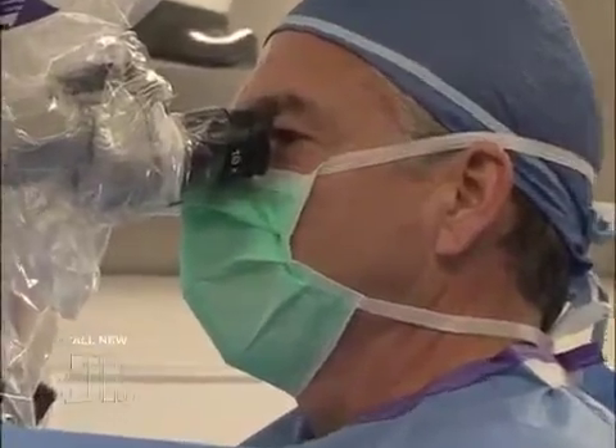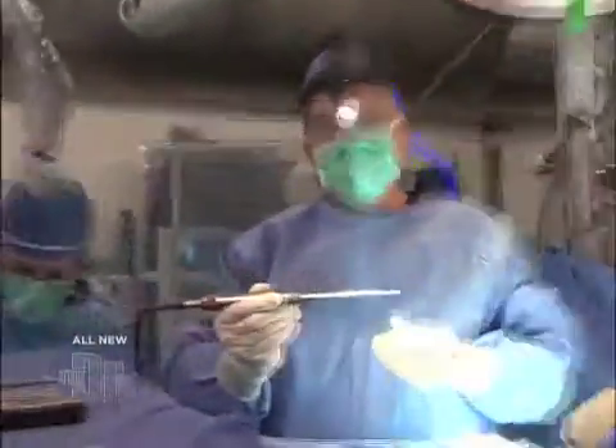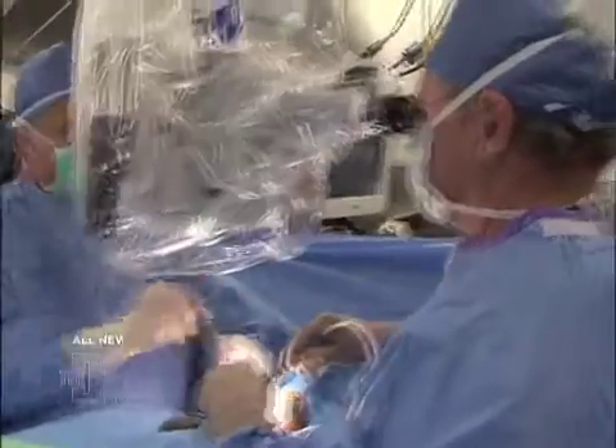There's really no disc left. This is almost bone on bone. This is a high-speed drill that we'll be using — it spins at 70,000 RPM, so it just makes dust out of all the bone and everything that's compressing the nerves.